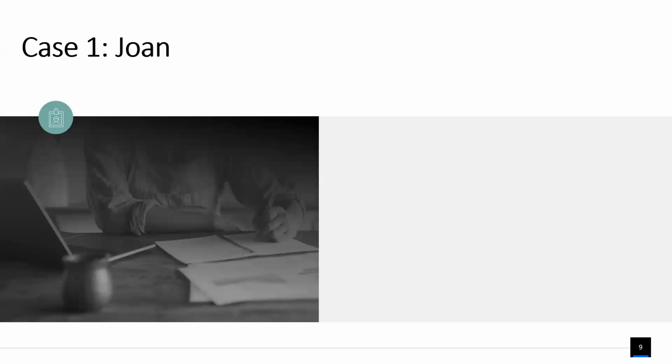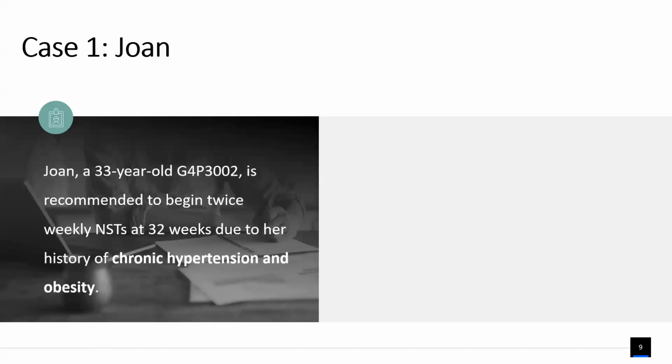And so just take a case, which I'm sure any of the clinicians on this webinar has faced something similar to, if not identical. So Joan is a 33-year-old G4P3002. So she's lost a pregnancy in the past. And now she's being recommended to have twice weekly testing starting at 32 weeks. And she also has comorbidities.